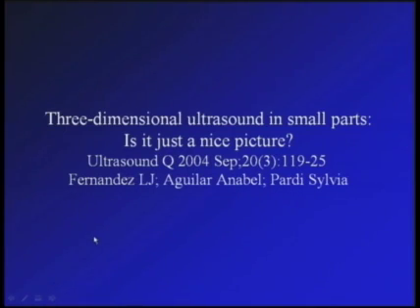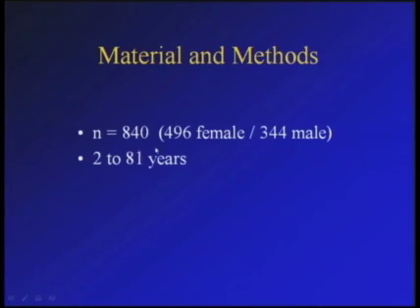Our group published this paper some years ago in 2004, and we tried to determine if it's just a nice picture or if it is affordable and can be done. We worked with more than 800 patients with an age of between 2 and 81 years old.